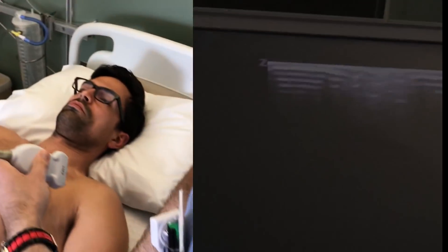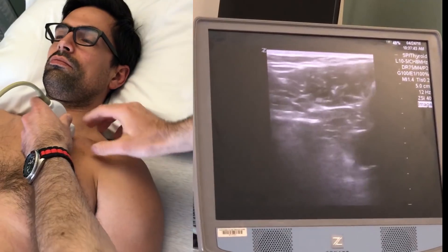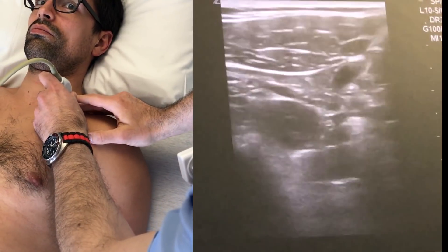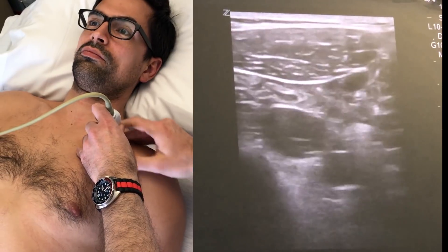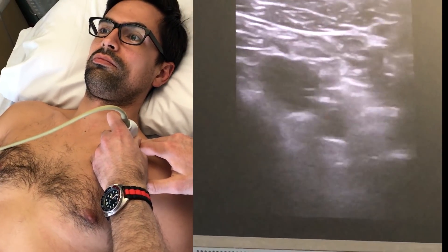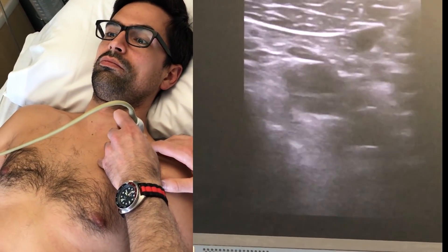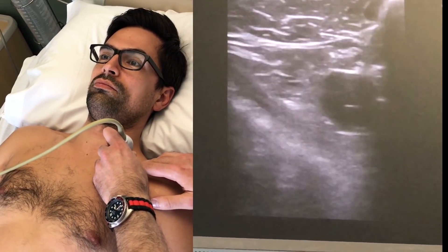Try to zoom in on the screen as much as you can. We're going to start out in neutral position, scanning in longitudinal position. That's the clavicle there on the right side of the screen. And then here you can start to see some vessels as we go laterally. That's going to be the subclavian vein there on the left. You can see it's a bit collapsible. And then subclavian artery on the right, although that's probably a bit more of the axillary artery.